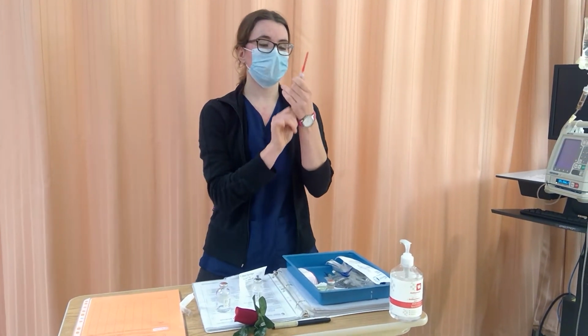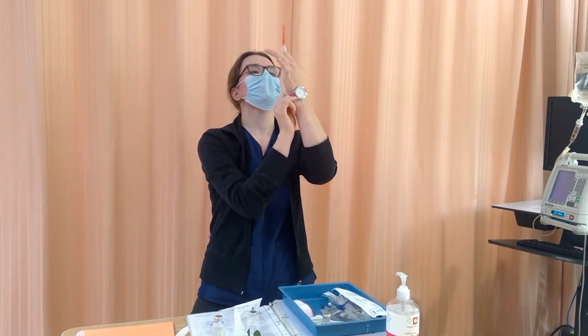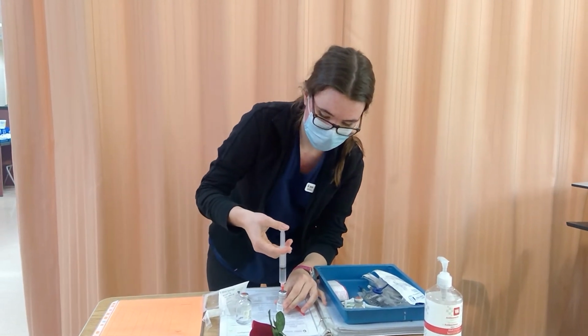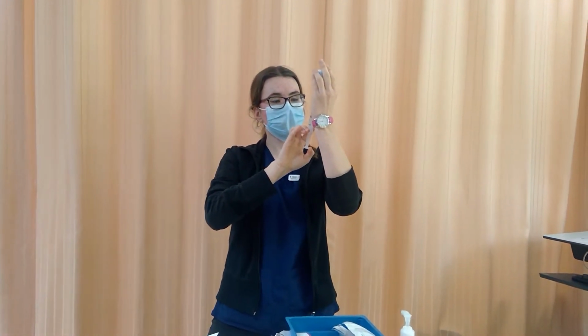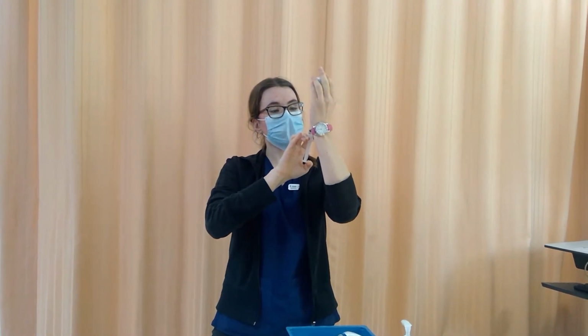Like we said, we're going to be drawing back 8.2 milliliters of sterile water because that is the order on the PDM. I'm going to insert that into there, flip, and draw back without contaminating. There we go.